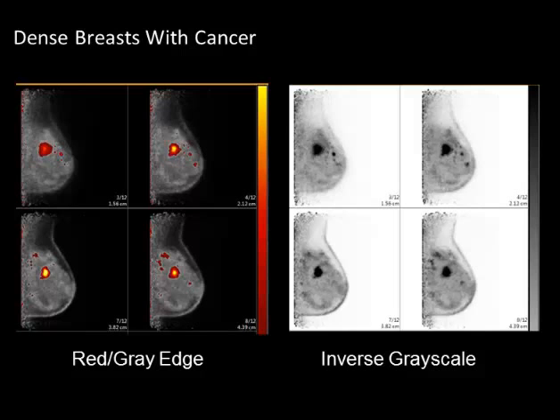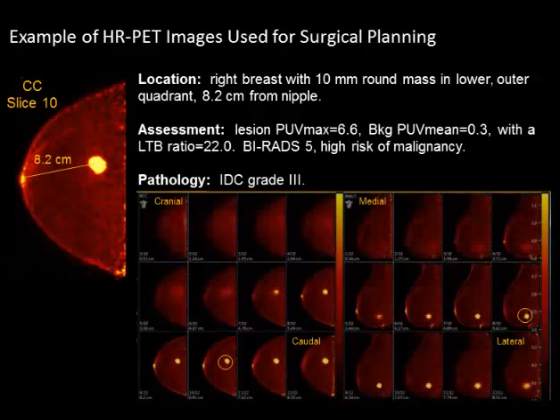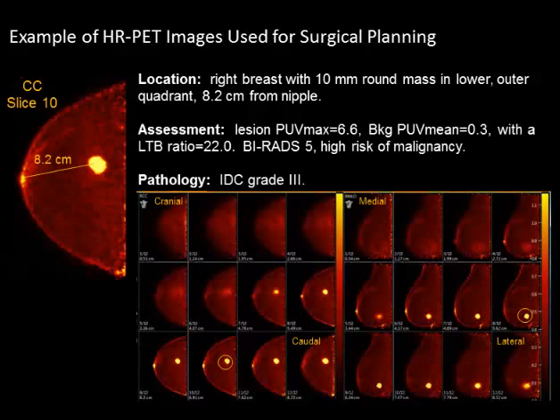So when you're trying to do those measurements to determine the extent of the lumpectomy that is needed, you get a little bit more of a scientific quantification. The other thing that we can quantify, as I said, is with regions of interest, what the different uptake is. The software also helps you with that. Visually, all of these lesions would look about the same on all of the slices. You draw your region of interest and then you ask the computer, find it in the hottest slice. And it does that for you. You draw your region of interest on the glandular tissue, and you say, calculate my lesion to background ratio.